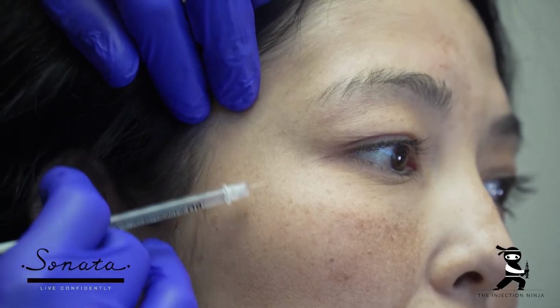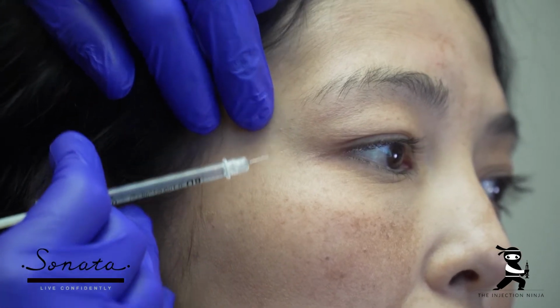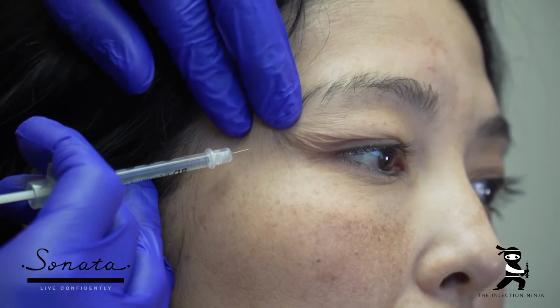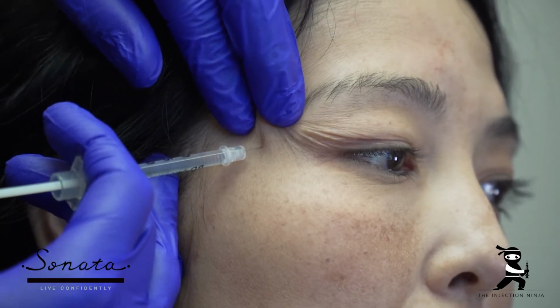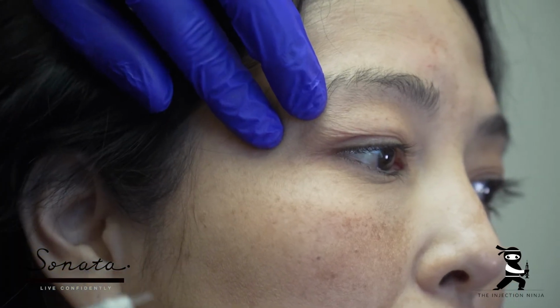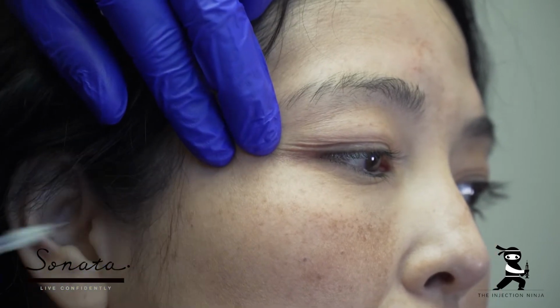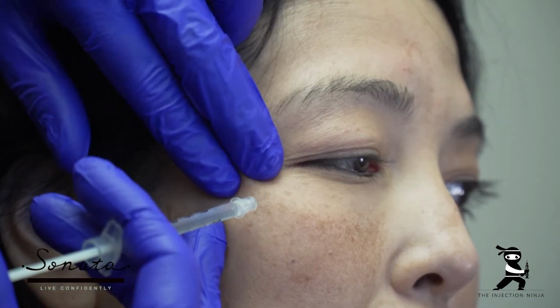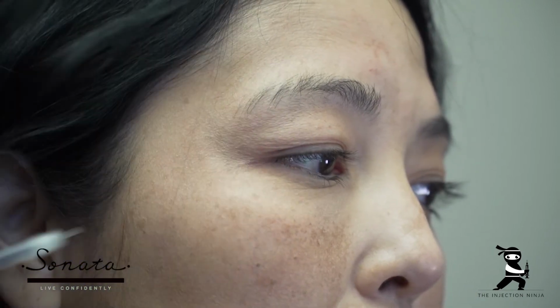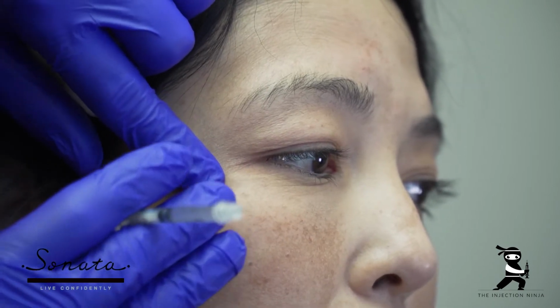So once again, we're going to use the snap technique around the crow's feet, 3 points, 1, 2, 3. And we're going to use a two-handed technique. Left hand is involved, right hand touches the skin very rapidly, moves through the dermis. You can push the product slowly, but you want to rapidly move that needle through the dermis while distracting at the same time with the left hand. This technique can be used with toxins or fillers, and I will demonstrate fillers momentarily.